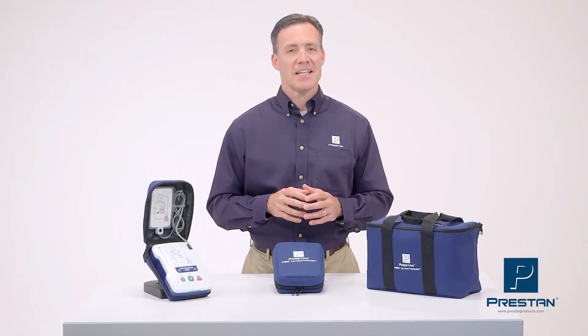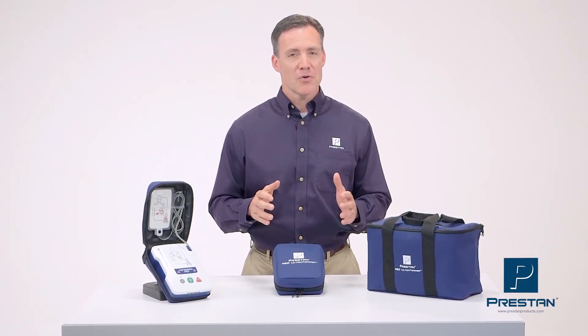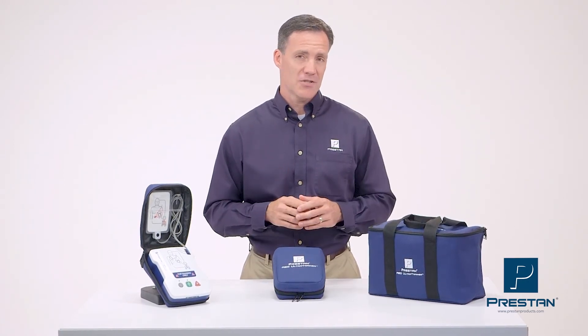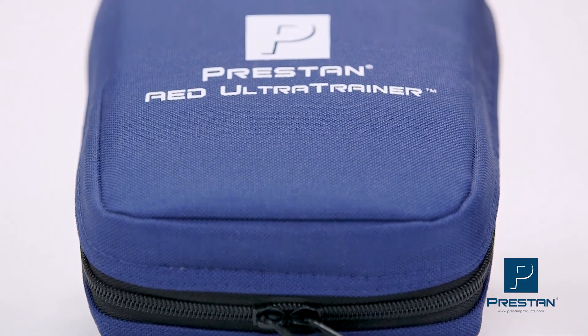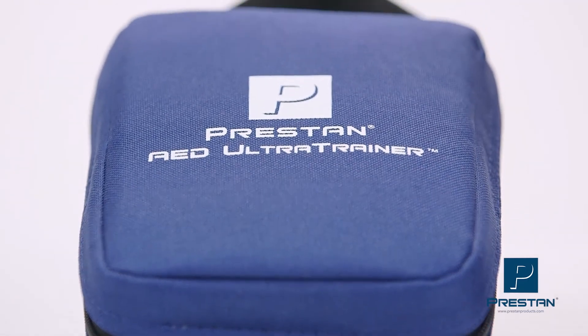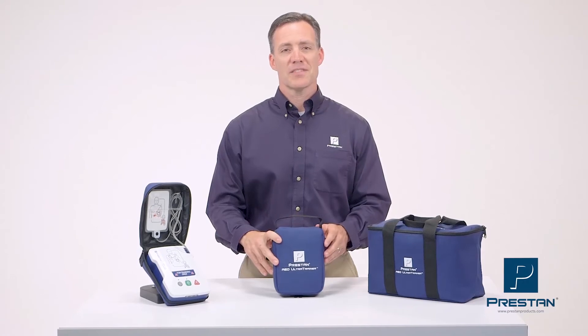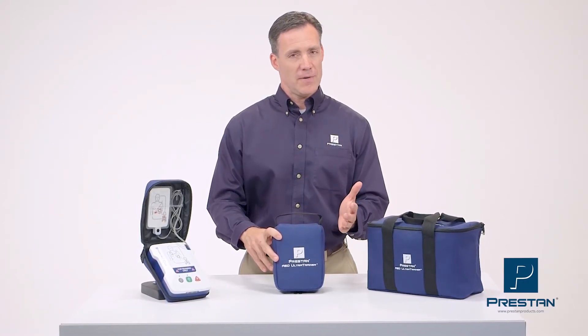The Preston AED Ultra Trainer is reliable, affordable, and will provide your students with a quality training experience. It is available as a single unit or convenient four-pack. Contact your Preston authorized distributor for more information today.